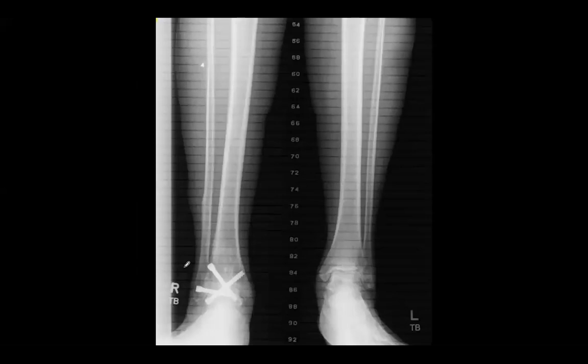And then lastly, if you're worried about somebody who's got a limb length discrepancy, you can get these scanogram images, which is basically 3 separate images where the radiologist puts a big radiopaque ruler underneath the patient and measures from their hips, their knees, and their legs. So you can actually identify where the deformity is. We can see their ankle joint on their right is around 86 and on their left is around 84. So you'd want to keep going up the line, and you can say, all right, are their kneecaps, their patellas, at the same level? Are their hips at the same level? For this patient, she actually had a hip fracture, so we went all the way up, and the deformity is all the way up at her hip. But this can allow you to plan distally too if you need to get those.